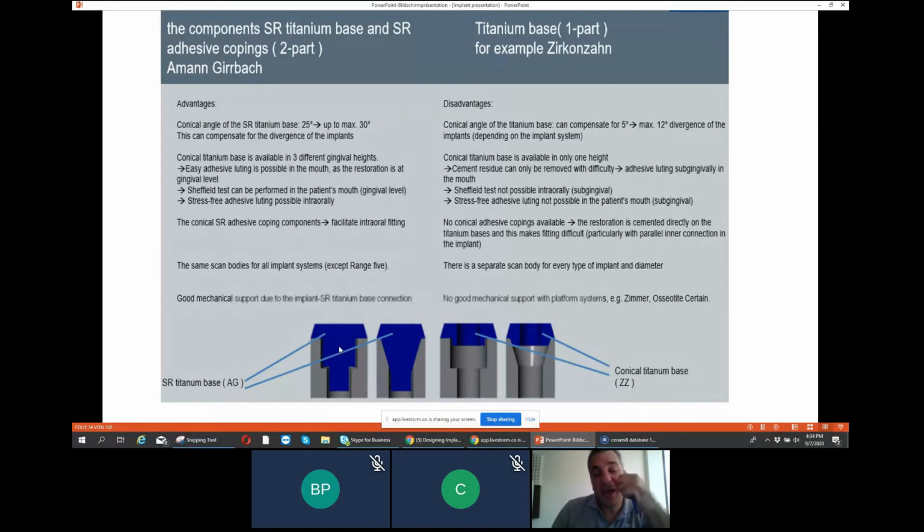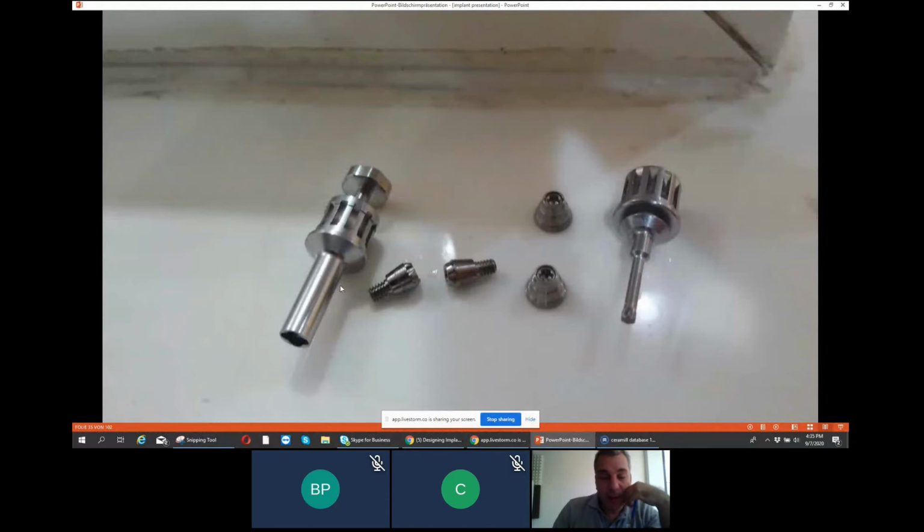So we tighten it well on the implant, up to 40 Newton, depending on the implants. And when we use the cap, we screw the cap, I think 15 to 20 Newton over these caps. In the workflow, as you can see, we have 2 screws, the normal screwdriver for these screws, and for the TiConnect SR, as I said, we have a special shape for the tip. So we need a special screwdriver, you see it here, that will hold this part and fix it in position.